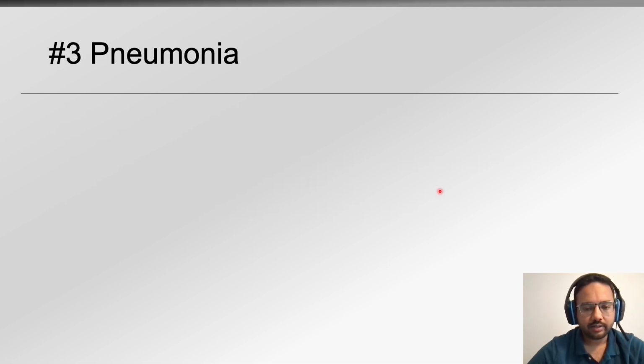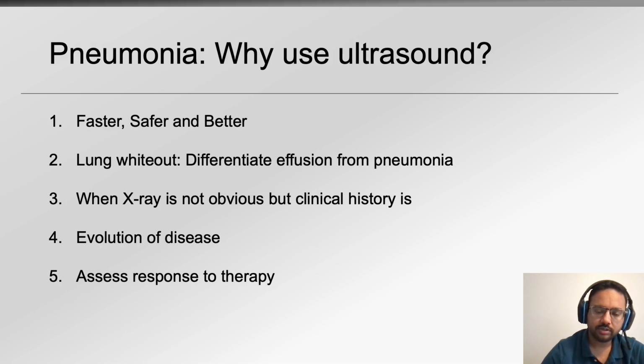The third diagnosis that I want to talk to you about is pneumonia. And it is such an important one for pediatrics because the literature has suggested that ultrasound is just way better at diagnosing pneumonia than a chest x-ray, which underdiagnoses it all the time. So a lot of times you can diagnose pneumonia by just physical exam or by using an x-ray. So what is the role of ultrasound?